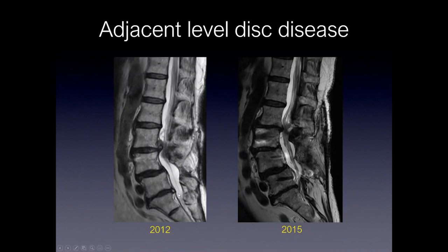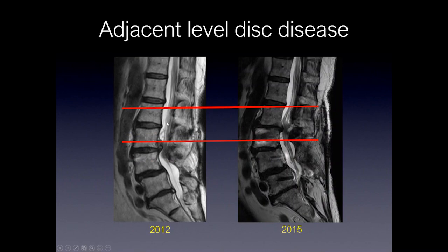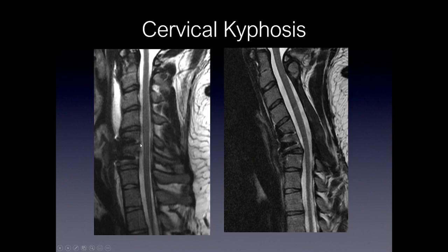Here's another example — this patient had a laminectomy in 2012 with multi-level disc disease. The patient was operated on, the disc was removed, the laminectomy was performed, and fusion was done — you can see the susceptibility from the hardware on MRI. The level above continues to develop degeneration over time, with a disc bulge forming, ligamentous changes, and now significant canal stenosis that was previously not there. Additionally, a patient who had a multilevel laminectomy without fusion can develop cervical kyphosis — another patient who had a laminectomy without posterior fusion underwent focal kyphosis as a result.